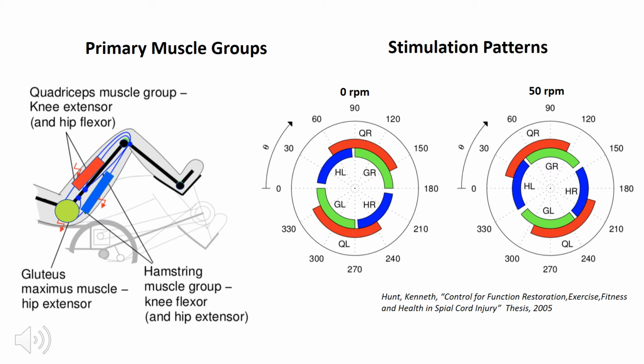Here, I would like to share with you a generic problem that comes up whenever you're trying to integrate stimulation with an exoskeleton system. Here again, it's cycling, it's not walking, but it is typical of the type of situations we come up with.